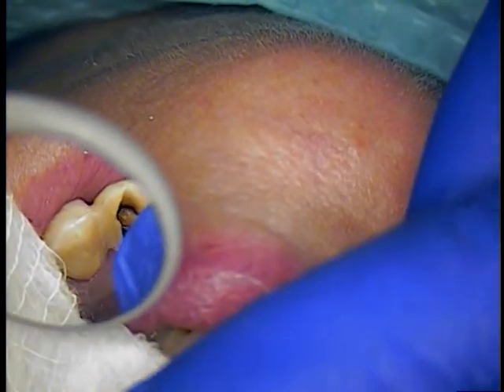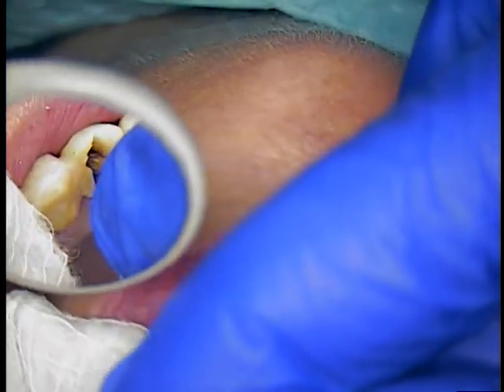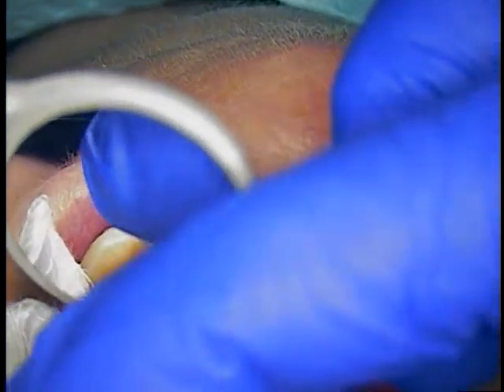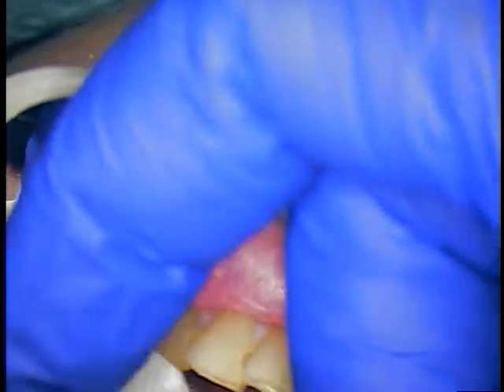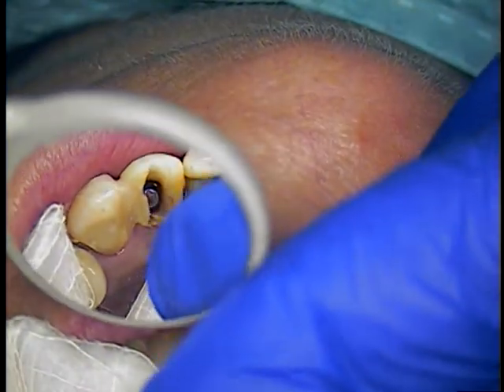And just going to go gently down. If it fits in there. If it's not going in, I'm not going to do anything. We'll just leave it. It did drop in. Okay. So now I'm just gently really feeling for just first point of tightness. That's it. That's all I'm going to do, just so that nothing goes down inside of this abutment.